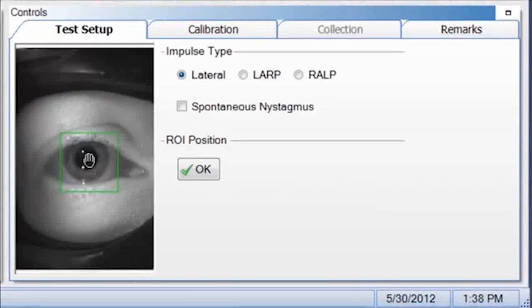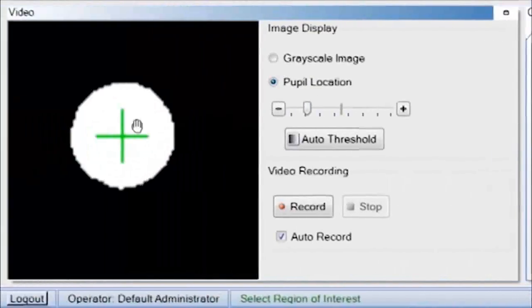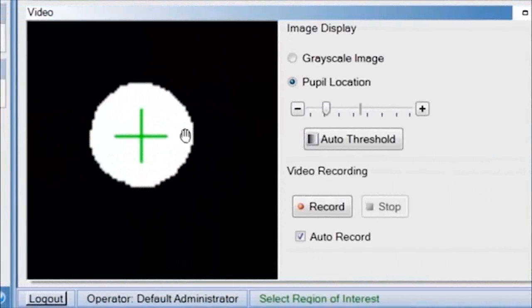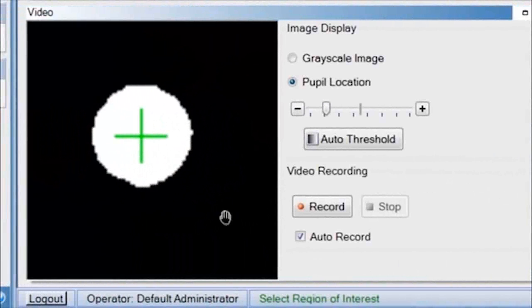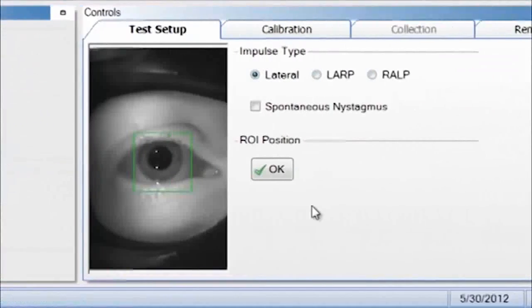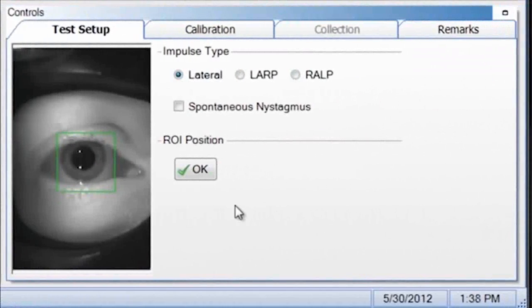And as you can see over on the left-hand side, the white is the pupil and the black is the background. Once you have the pupil centered in the green ROI box, you want to click OK.